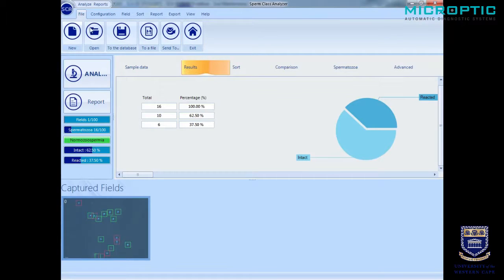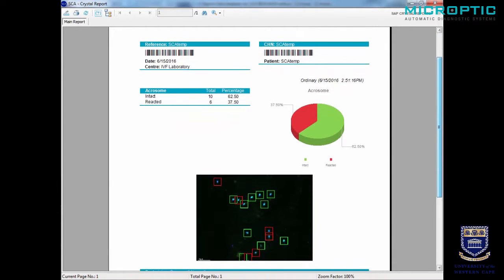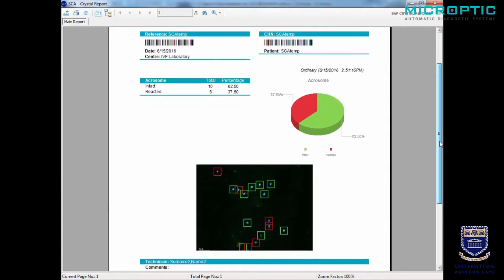Going back to the results section, we can see a little window showing us the results. We can do several fields until we have approximately 200 spermatozoa. Finally, we can compare the sample with acrosome intact — the control — versus acrosome-reacted, the one exposed to the calcium-based substance. There should ideally be about 15% difference between the control acrosome versus the acrosome-reacted spermatozoa. We can finally create a report showing a pie diagram, a table, and proof that the acrosomes have been correctly detected.